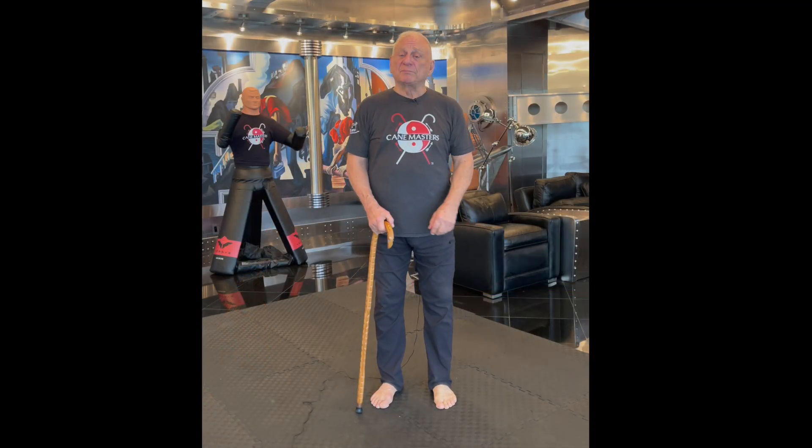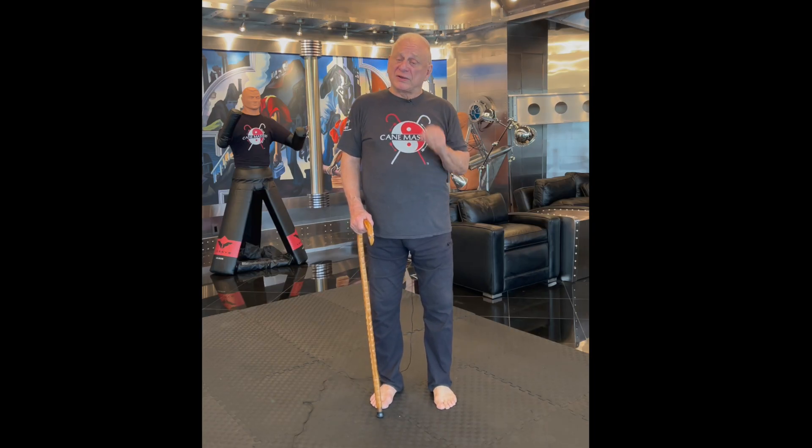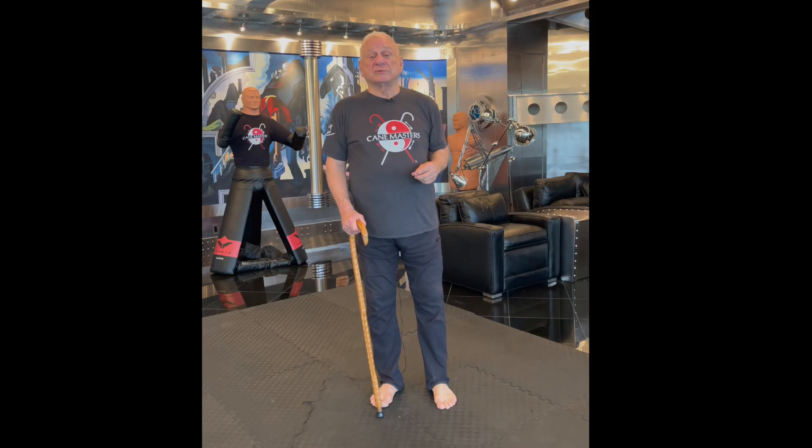Hi, I'm Keith Melton, the president of Cane Masters. We are the sole remaining custom cane company in the United States, and we have the great pleasure of working with people daily to help them know how to walk with and use a cane.